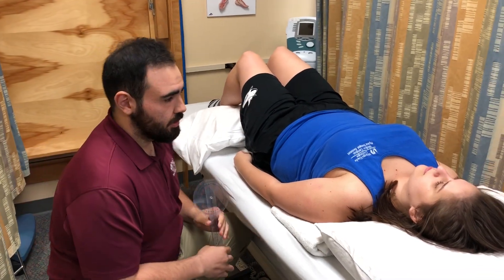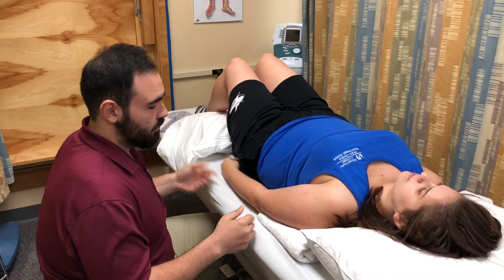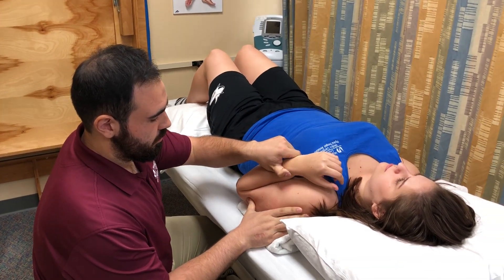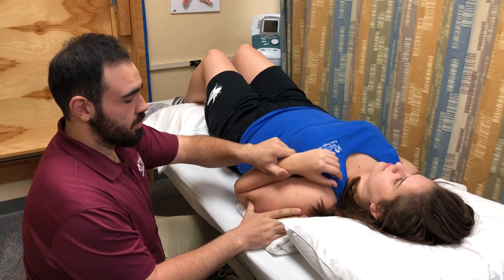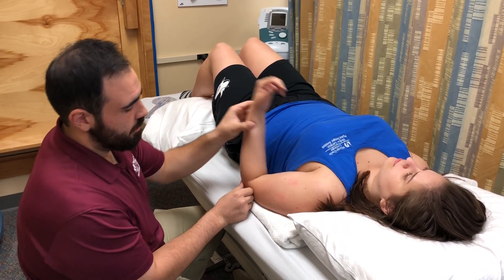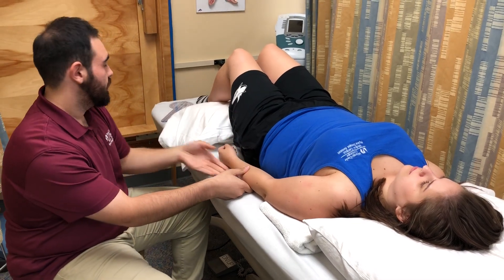I just placed the patient in the testing position. I'm now going to move the patient through the available range. The end feel is soft. A visual estimate, it looks about 145 degrees. I'm going to place the patient back in the starting position.